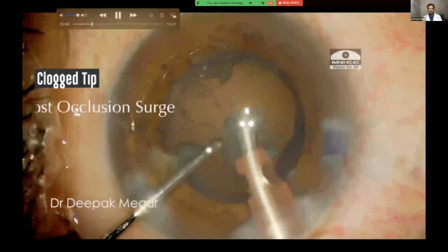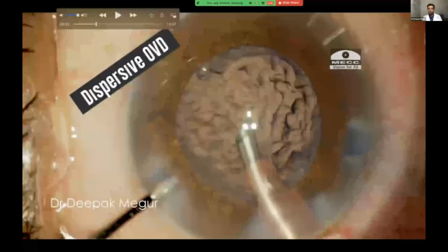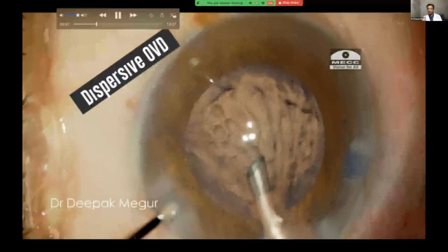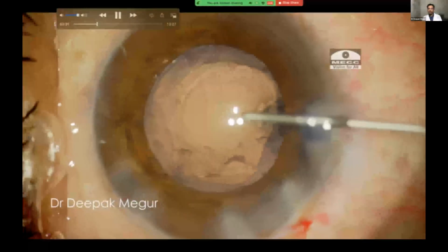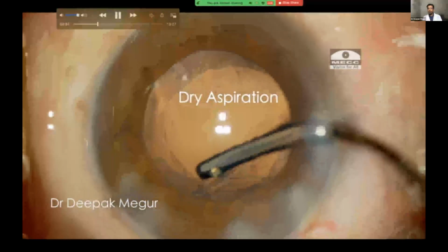And this is another classical case, when you have a post-occlusion surge in phacoemulsification, you have the PC getting caught here, and we have a posterior capsular tear. Again, the same principle is to be followed. You want to put in the OVD without removing your irrigation handpiece. As a reflex, we will have a tendency to remove it, but if you can do that, the sudden shallowing of the anterior chamber does not happen, and we can always maintain the anterior hyaloid face.